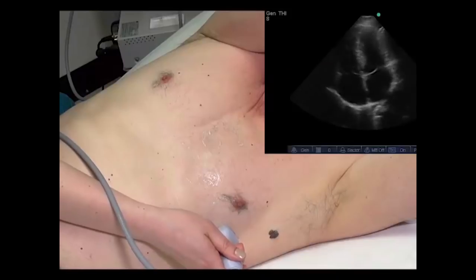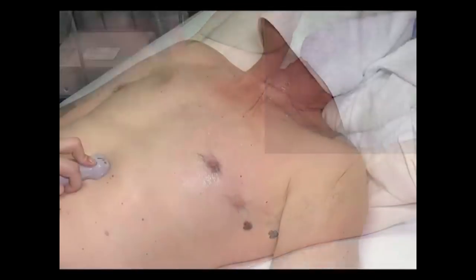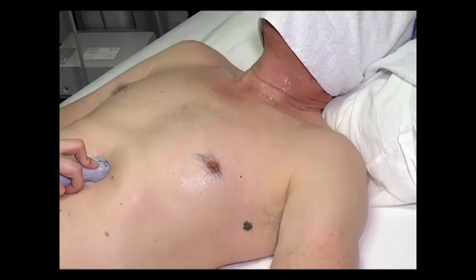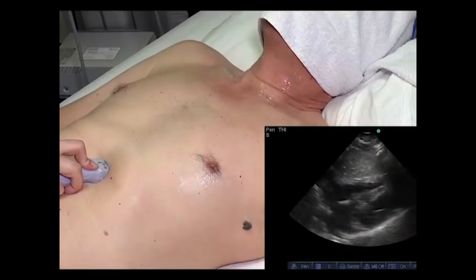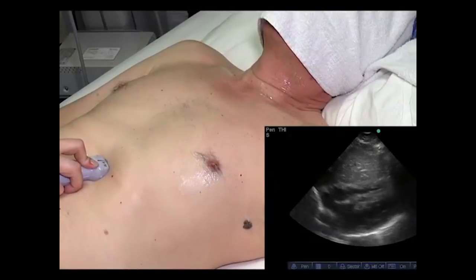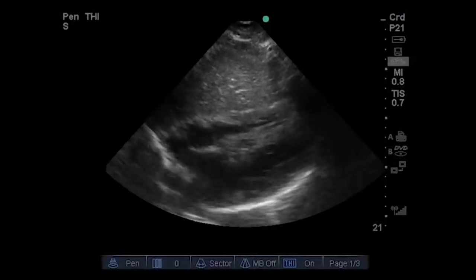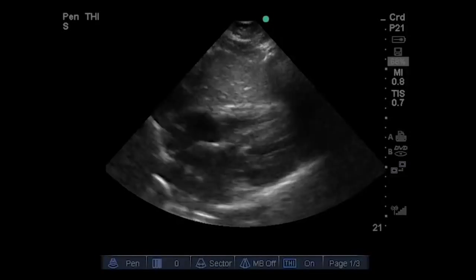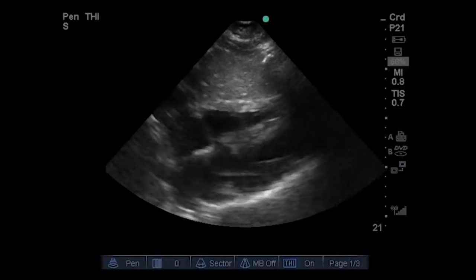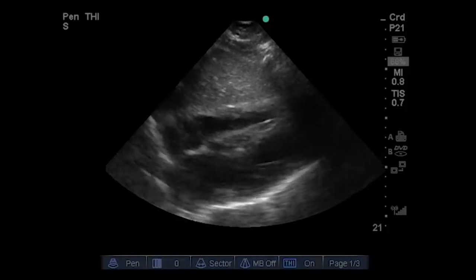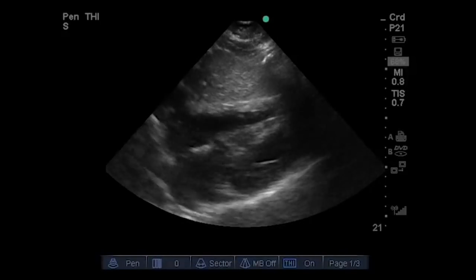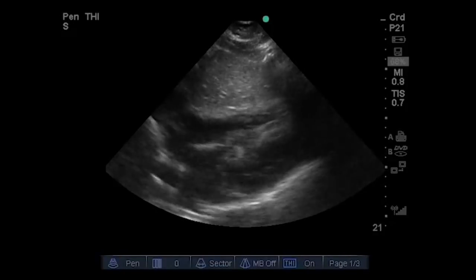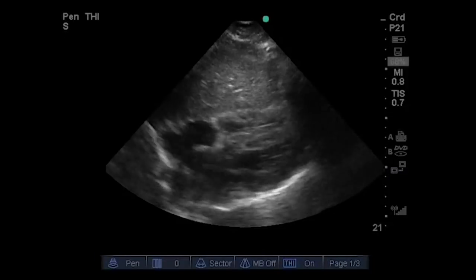The fourth mandatory view for the goal-directed echocardiography exam is the subcostal view. Here the probe is moved to the sub-xiphoid position. The probe marker is directed to the patient's left and depth is appropriate for good image quality here. The axis requirement is that the ventricular cavities are largest in volume, requiring adjustment of the angle, the tilt, and a little bit of movement of the probe. The main purpose of this view is to compare the size of the RV to the LV, to look for pericardial effusion, and to evaluate in long axis the LV function.